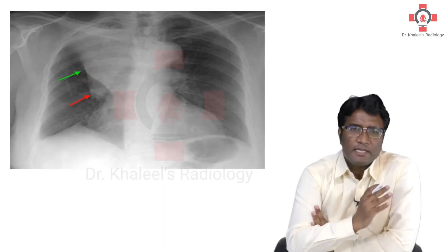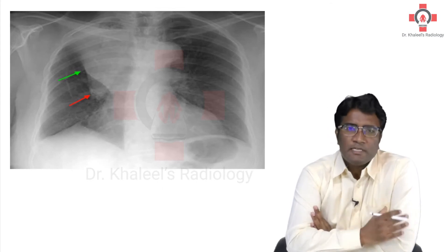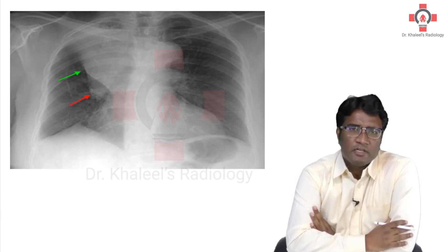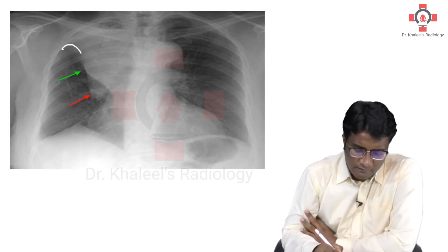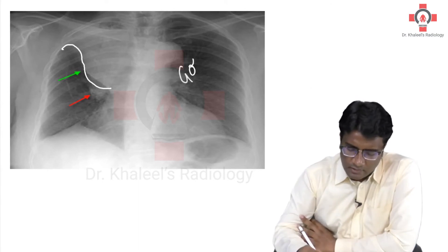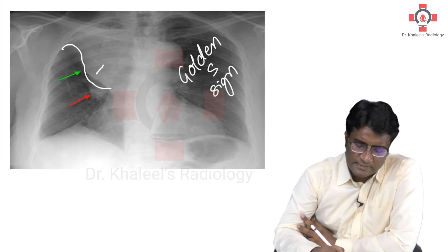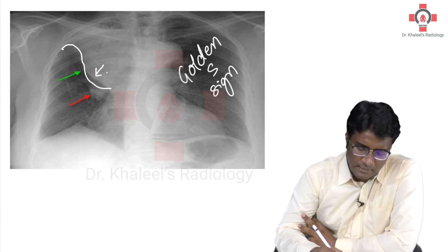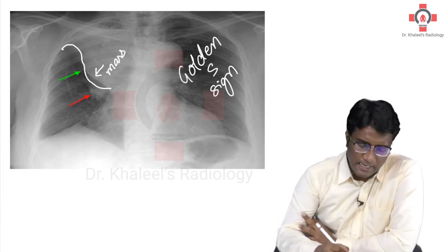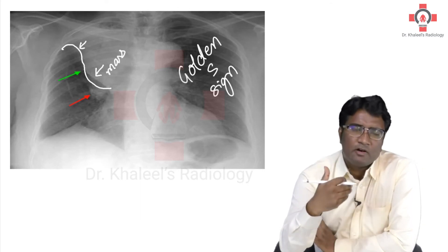Please look at this image. In this image, we can see that there is an obvious pathology in the right upper lobe. If you see carefully, you are seeing that there is an upper concavity and a lower convexity, and this reverse S-like appearance has been called the Golden S sign. Remember, the lower convexity is caused by a mass — a bronchogenic carcinoma — and the upper concavity is because of right upper lobe atelectasis or collapse that occurred because of this mass compressing that area.